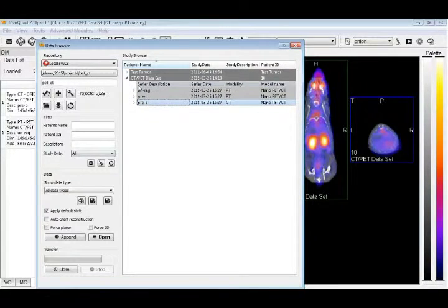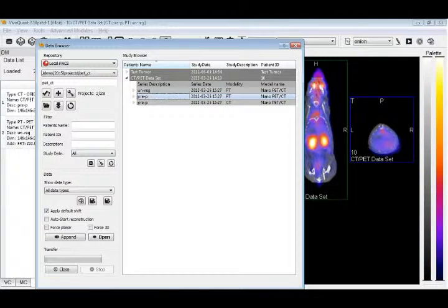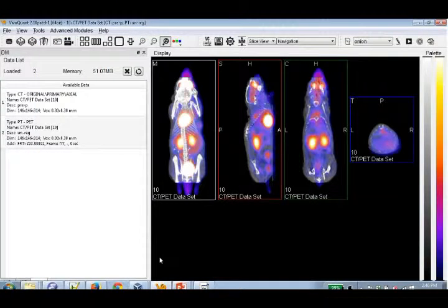Let's make it a little simpler and say I want to take individual. Let's loop through my series then, since we're having a little trouble with this study up here. Let's loop through all three of these series and take each one individually. Why don't you say the mid-movie of each of them? Sounds good. I'm getting live instructions.